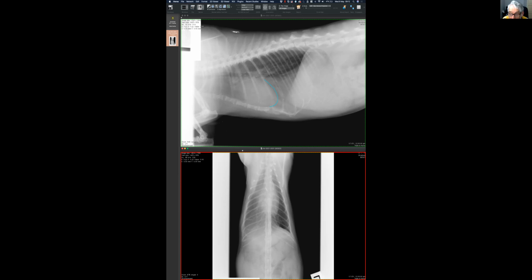Okay. Anything else? It's an adult dog. Its epiphyses are fused. Its abdominal detail is heading towards a ground glass appearance. So I suspect that it's either not fat, whereas body condition looks reasonable from other areas of the body. So I sort of suspect it could be abdominal fluid. Then cranial to the heart and at the carina there seems to be what's probably edema. Not nodules. I don't want to get a reputation as the nodule man.